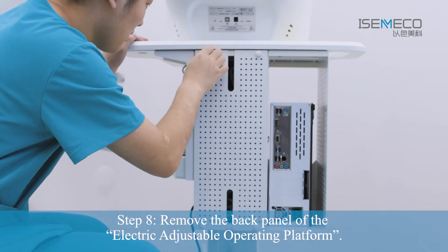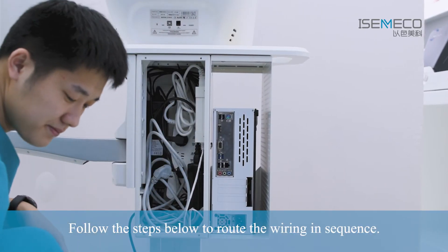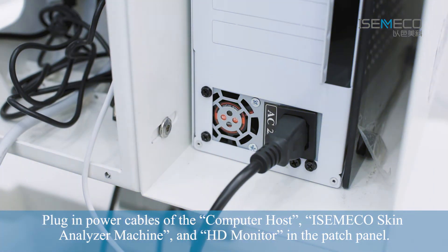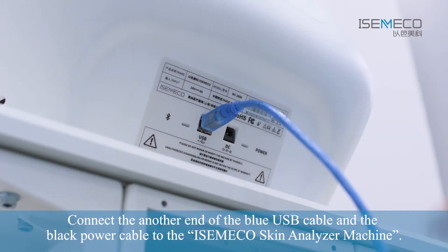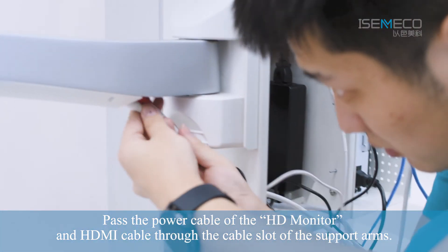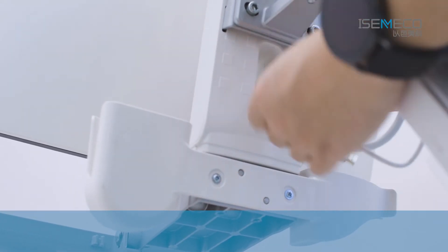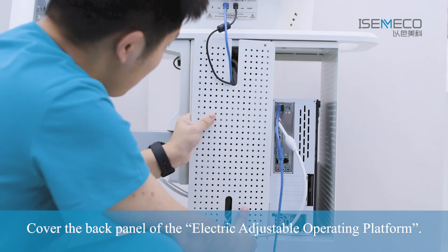Step 8: Remove the back panel of the Electric Adjustable Operating Platform. Follow the steps below to route the wiring in sequence: Plug in the HDMI cable of the HD Monitor, Encrypted USB, and Blue USB Cable on the Computer Host. Plug in power cables of the Computer Host, ISEMECO Skin Analyzer Machine, and HD Monitor in the Patch Panel. Connect the other end of the Blue USB Cable and the Black Power Cable to the ISEMECO Skin Analyzer Machine. Pass the Power Cable of the HD Monitor and HDMI Cable through the cable slot of the support arms. Connect the White Power Cable and HDMI to the HD Monitor. Cover the back panel of the Electric Adjustable Operating Platform.